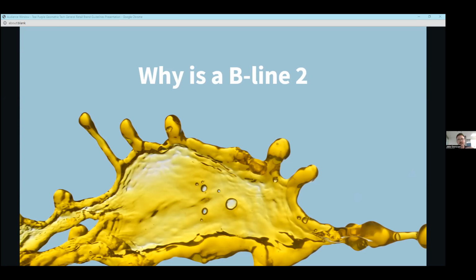And that's if it's located at the surface of the lung, which roughly 95 to 98% of times it is. And this leads to the same mechanism where the sound now has an acoustic window to go in, and it interfaces with this fluid-air interface, bouncing back and forth, creating the B line. And once it gets to a certain volume, this other theory is similar to how consolidation is formed. And you might see that tissue-like echo texture once it progresses to a certain point.